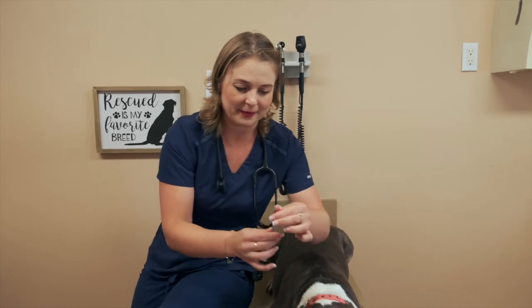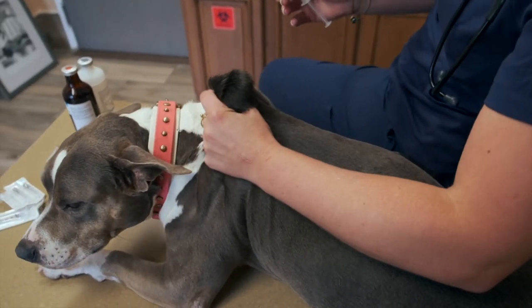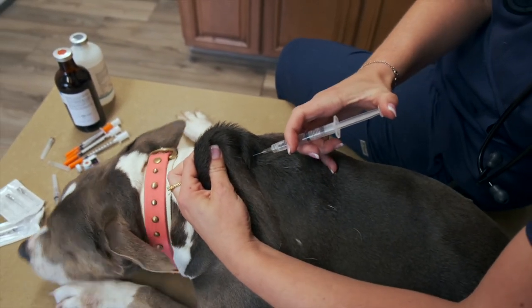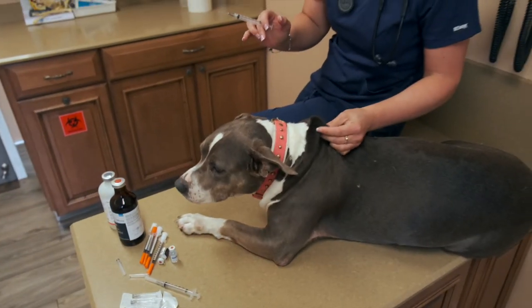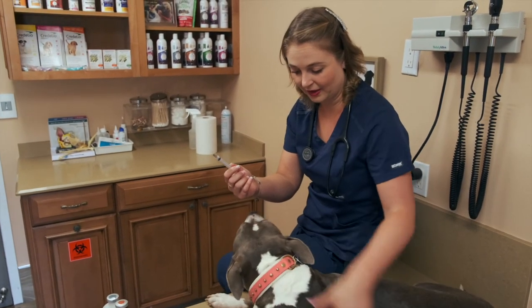I'm going to take the cap off. Bella is a great dog, but if you can't hold your dog yourself you might need a friend to help. I'm going to do this all by myself, which is what most of you will be doing. I'm giving her the shot in the middle of the back between her shoulder blades. I grab all this skin, tent it up, go right into that tent, and inject with some force. She didn't even feel it — medication is in, all done. No bleeding. You can pinch the site if you want.